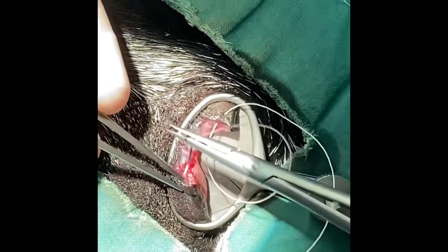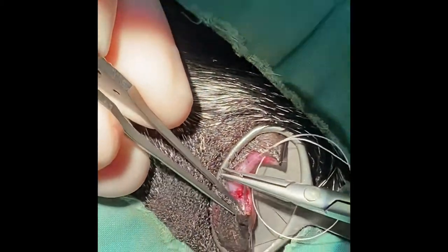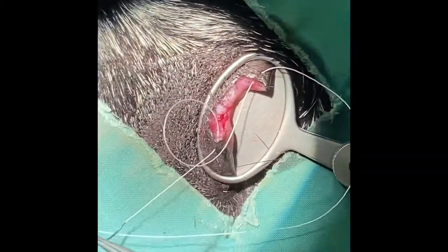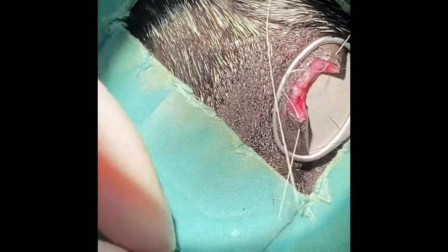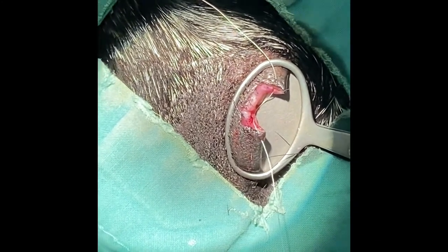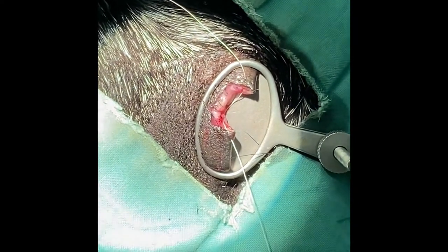First of all, you place the initial suture approximately three to four millimetres away from the eyelid margin, exiting slightly closer, and then entering on the opposite side of the wound about two millimetres away from the eyelid margin, two millimetres proximal to it.